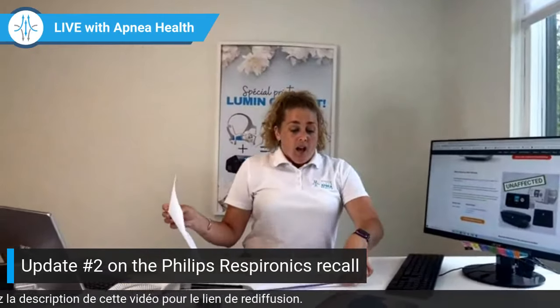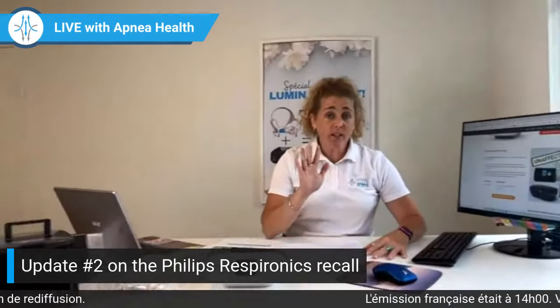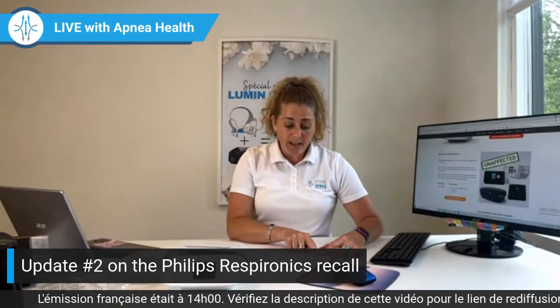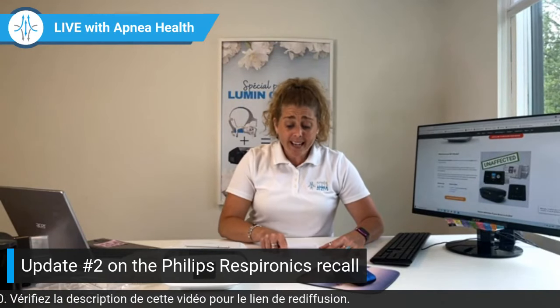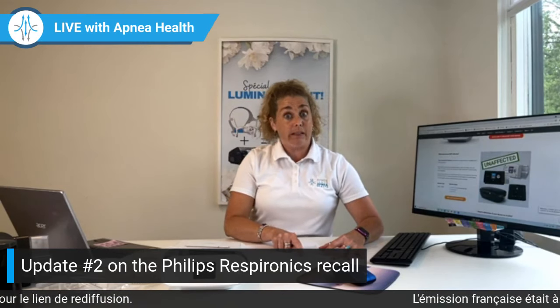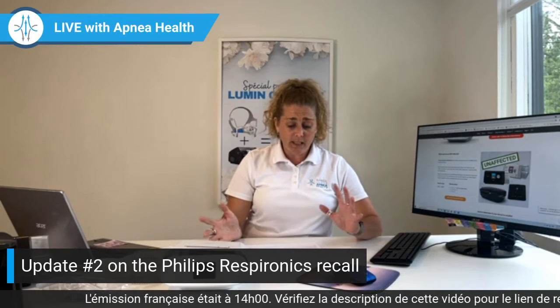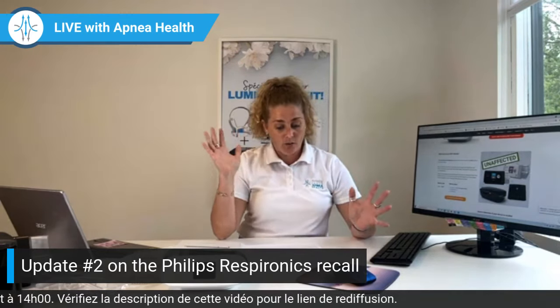So, okay, now back to business. According to Philips, and I quote, the foam may degrade into particles which may enter the device's air pathway and be ingested or inhaled by the user. And the foam may off-gas certain chemicals that may be toxic and can irritate airways, cause headaches, and possibly carry a cancer risk. Now that sounds scary, I know, right?